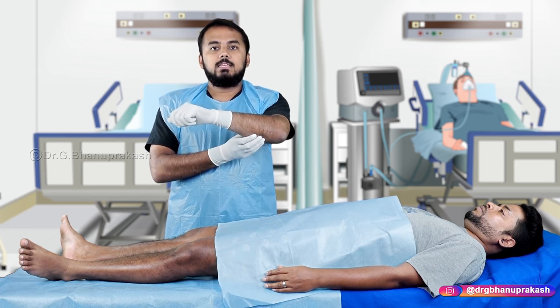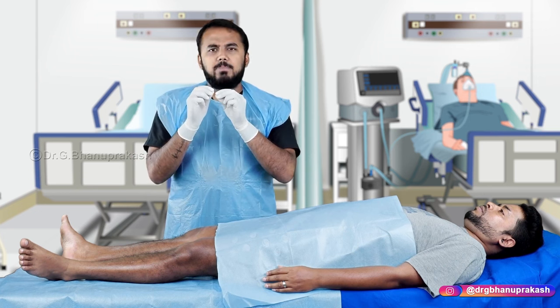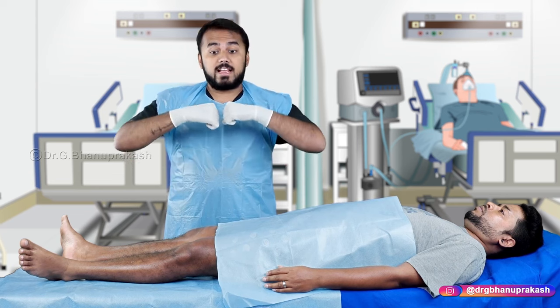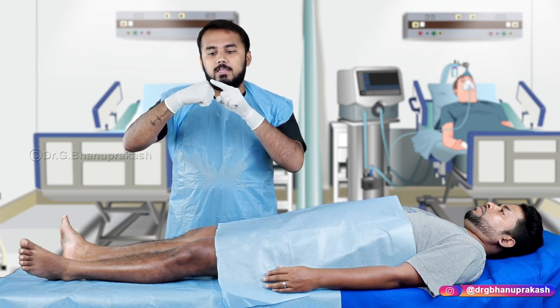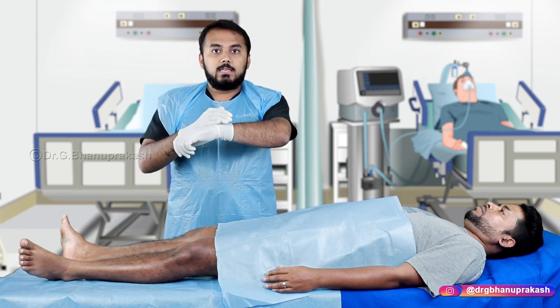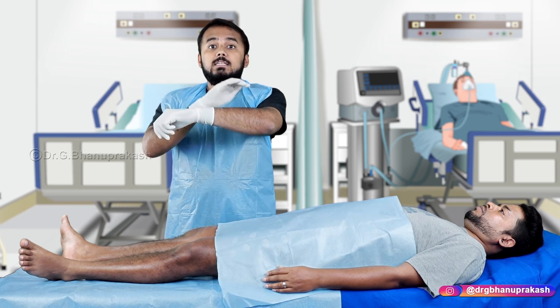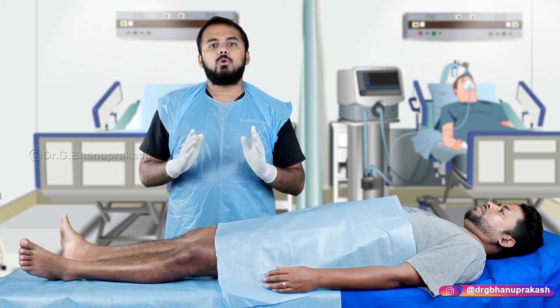When do you apply slab vs cast? For a simple hairline fracture — for example a scaphoid fracture — we apply cast. But when there is a displaced fracture, we apply slab, because the serrated ends of fracture fragments pierce surrounding tissue causing swelling. If you apply cast over swelling, the fluid cannot resolve. With slab, the open surface allows edematous fluid to drain and swelling to reduce.